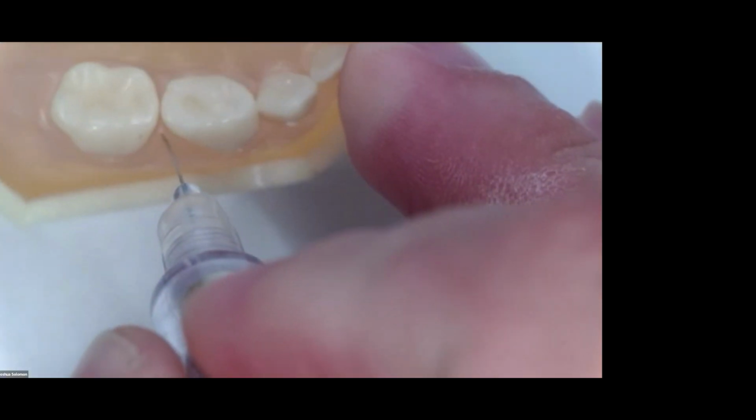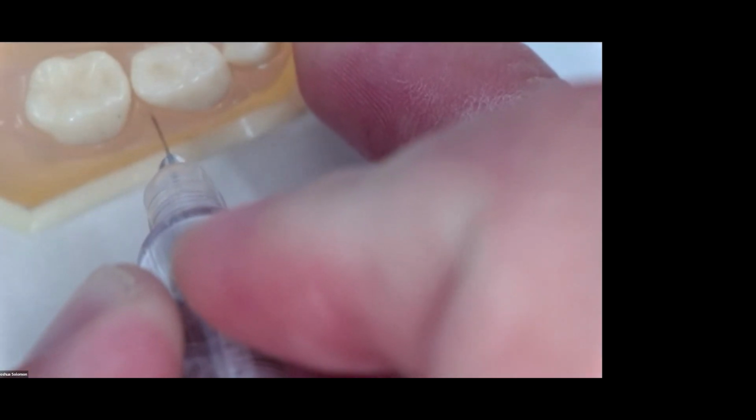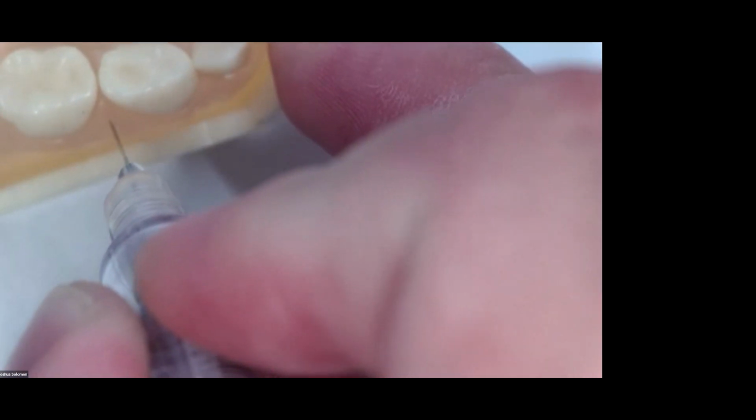Now I'm going to switch positions. I'm going to just focus here. So I'm coming in at about a 45-degree angle. I'm in line with the bone. Perfect. What I don't want you to do is, as you initially start to put a little pressure down, you see if you come off angle a little bit, your needle can bend. So I'm really making sure that that pressure is down the long axis of the unit. I'm coming in at about 45 degrees, and I'm pressure, and then pop through.